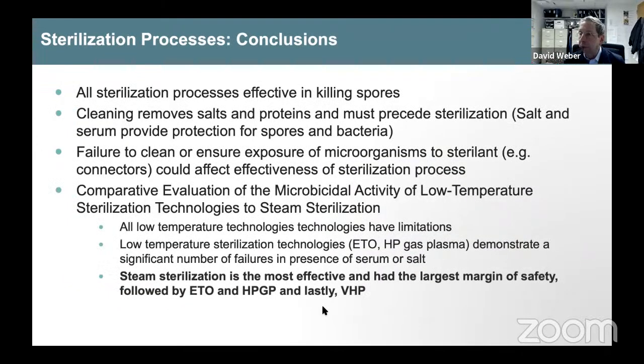All sterilization processes are effective in killing spores. Cleaning is critical to remove proteins and salts. Failure to clean or ensure exposure to the sterilant could affect the effectiveness of the sterilization process. So for instance, if you have a long, narrow lumened tube and you don't connect it to the sterilization process, passive flow is not adequate. You need active flow for a low temperature method. All the low temperature technologies have some limitations. Some of them that are used, ETO, HP gas plasma, and in the presence of salt and serum, they can fail. So cleaning is critical. And of course, steam sterilization is the best method.